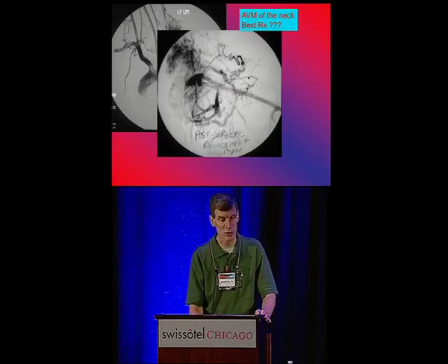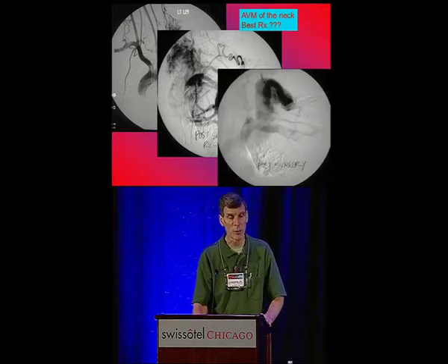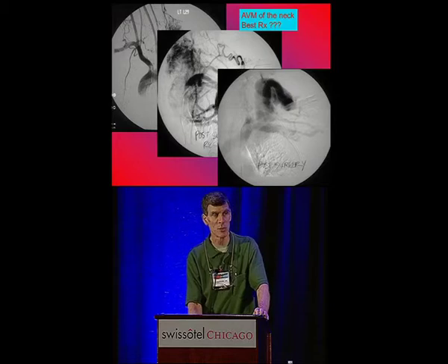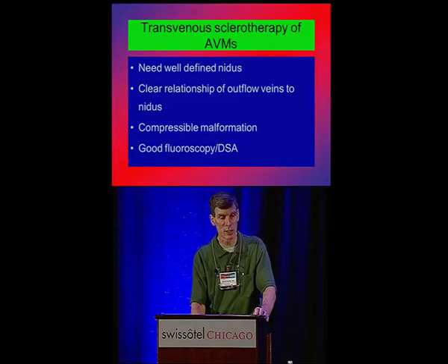And after surgery, you can see that the amount of flow was markedly reduced, and we went back and controlled a couple of those big, huge veins with coils and some sclerotherapy, and the patient did quite well. My favorite, as I said, is transvenous sclerotherapy.